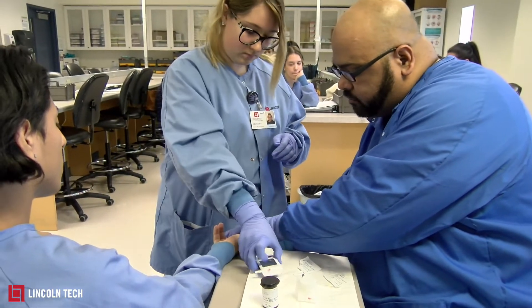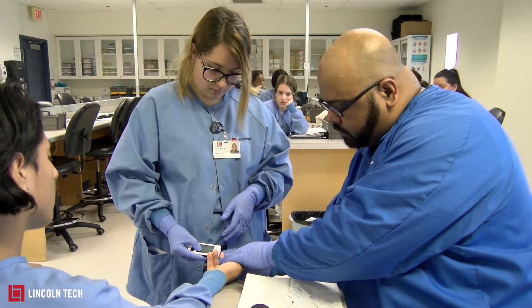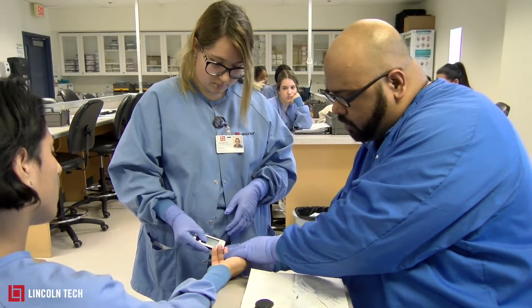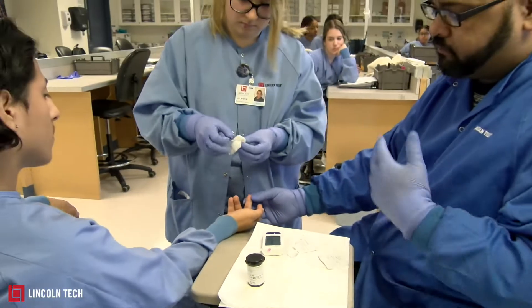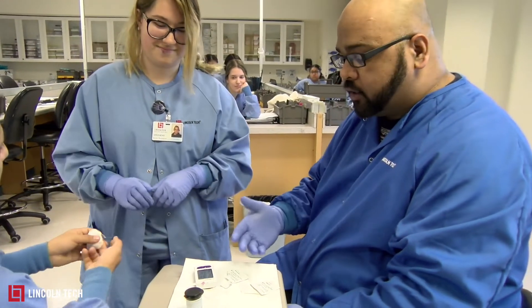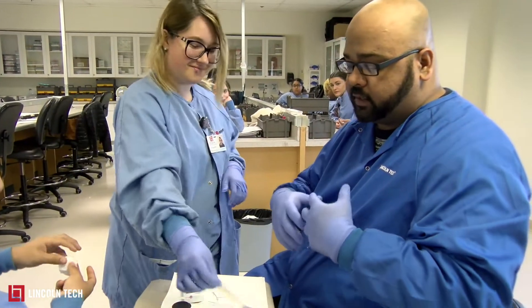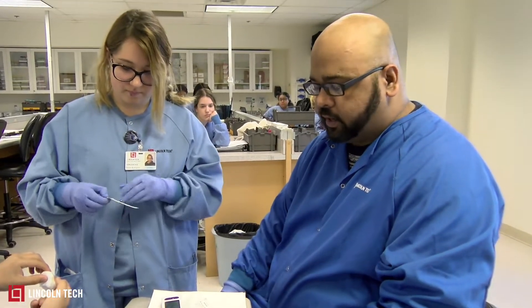Apply enough pressure for the blood to come out, then she's going to touch the tip of the glucose strip — the blood will go down and you'll hear a beep. She takes the gauze pad, and in five seconds it gives a reading. His value falls in the normal range, which is 70 to 110 milligrams per deciliter.